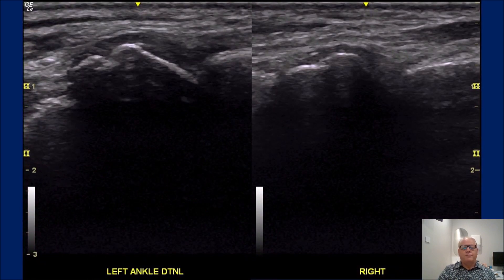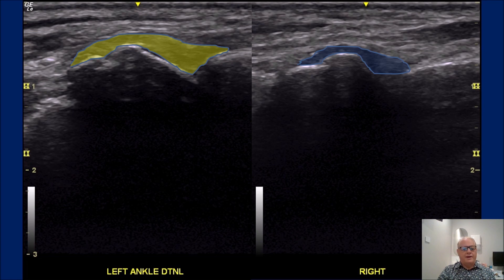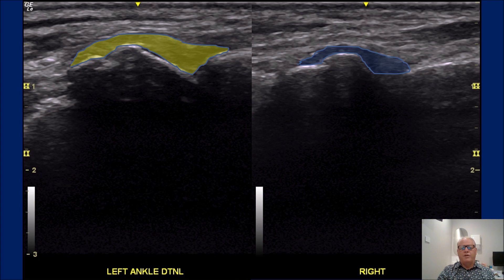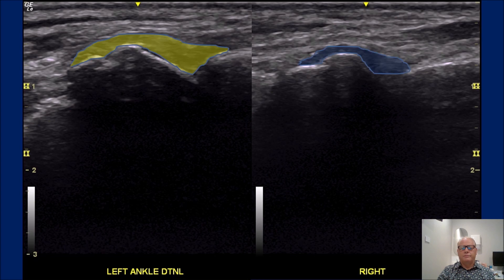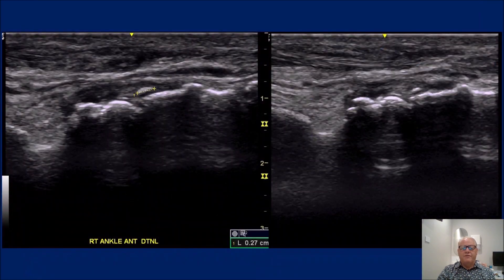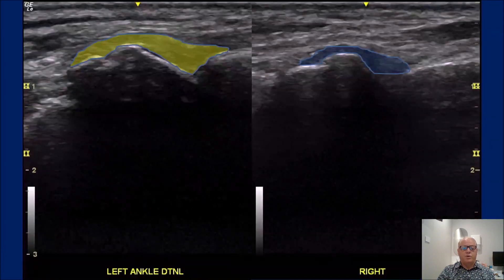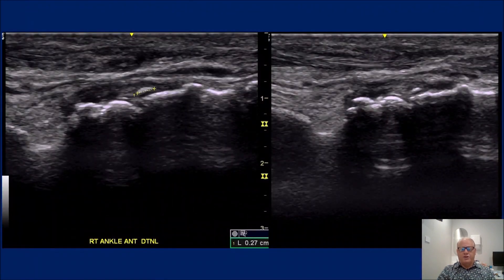Here we have an injured talonavicular ligament on the left in yellow and normal on the right. There may or may not be a degree of bony irregularity. In fact, here's one that we've scanned that has a small avulsion fracture of the talus and the navicular in that area.